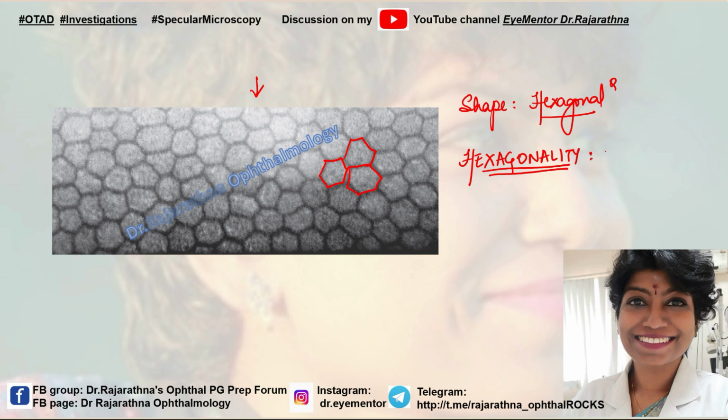So what is a normal hexagonality? 70 to 80% is the number of hexagonal cells. That is, if you're seeing 100 cells, 70 to 80 of them would be hexagonal in a normal cornea. Now, why should you know about hexagonality? Because hexagonality tells us the state of endothelial healing. If there's some damage to the endothelial layer, there can be some disturbance in this hexagonal shape. So hexagonality gives an idea about how well the endothelial wound healing is happening.